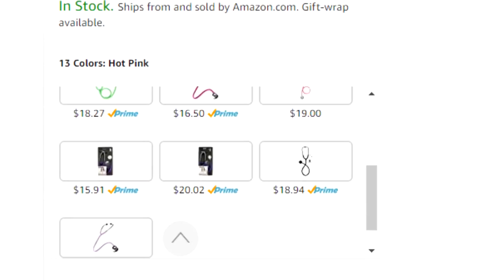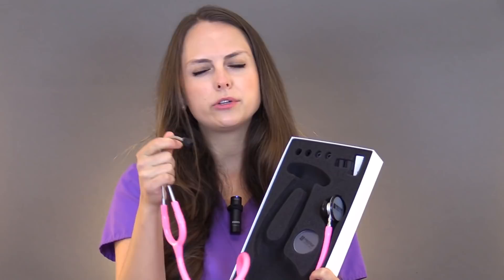Now let's talk about what this stethoscope comes with. This particular one is the Clinical Light series, model 121, and it comes in various colors. I love pink and purple so I went with hot pink. It comes with the stethoscope itself, and it has extra ear tips. I love these ear tips — they're really soft and they have a really good seal in my ear, very comfortable to wear.